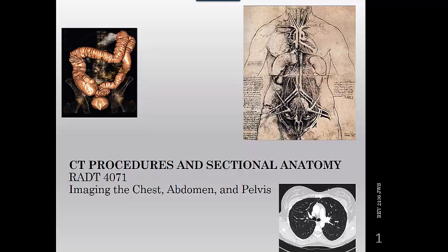The use of IV contrast is typically requested by the radiologist to differentiate vascular from non-vascular structures, particularly lymph nodes, and to evaluate cardiovascular structures by seeing the inside structures and to further characterize lesions by observing their pattern of enhancement.